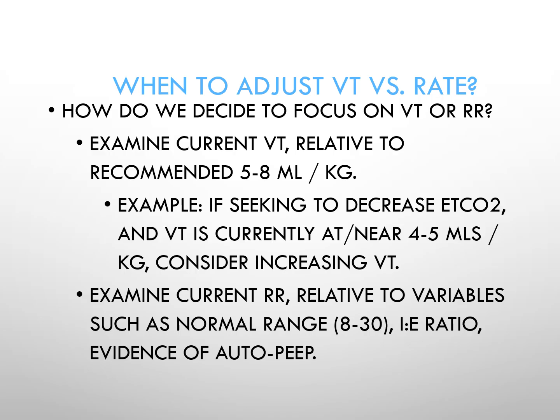The other end of the spectrum would be, if you're looking to decrease the end-tidal CO2 and your tidal volume is already at 8 mLs per kg, but your respiratory rate is set at, let's say, 10 or 12, then look to increase the respiratory rate. Of course, looking at your IE ratio, evidence of auto-PEEP, and things along those lines.